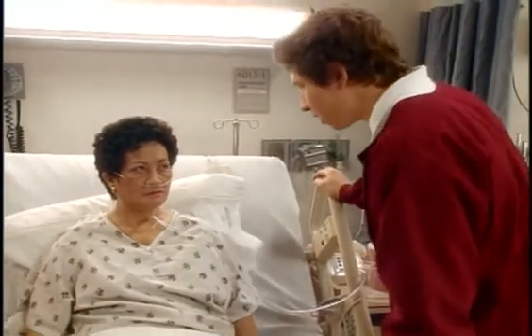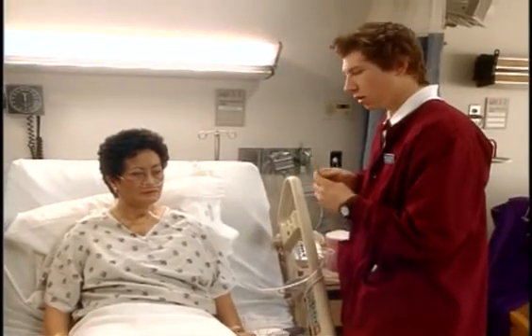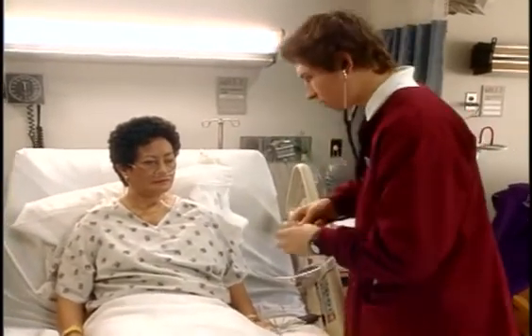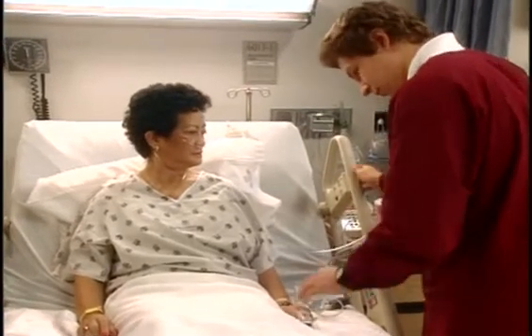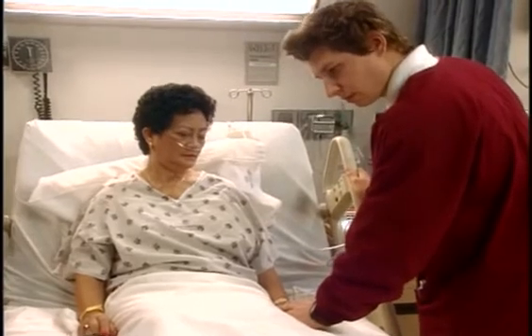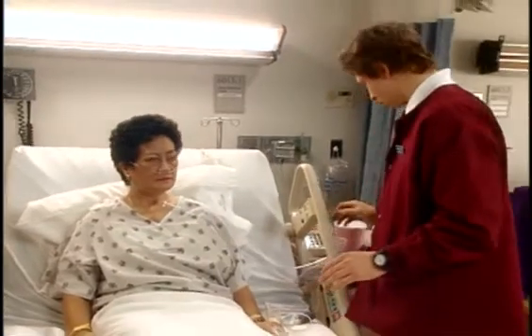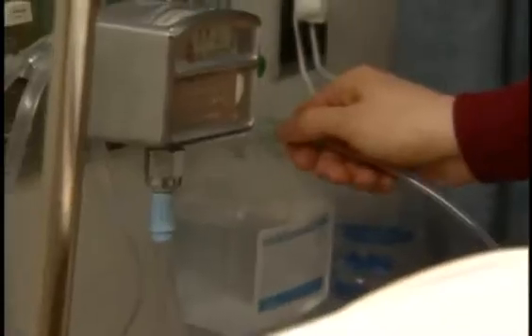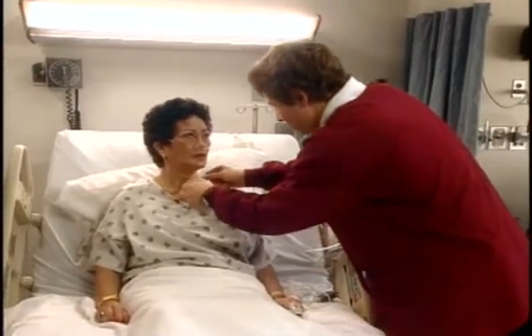Okay, Melissa, what should you do? Well, I'd evaluate all current data to determine if the patient is in distress. But she didn't appear to be short of breath or in distress. No. Okay, then check all the connections to the pulse oximeter and make sure the patient held the sensor still. What else? Maybe try a different site for the oximeter. Good. But what did you do, Mark? Well, I checked the oxygen system, the flow meter, the tubing, the connections for patency, and then I used the earlobe sensor. And then what?